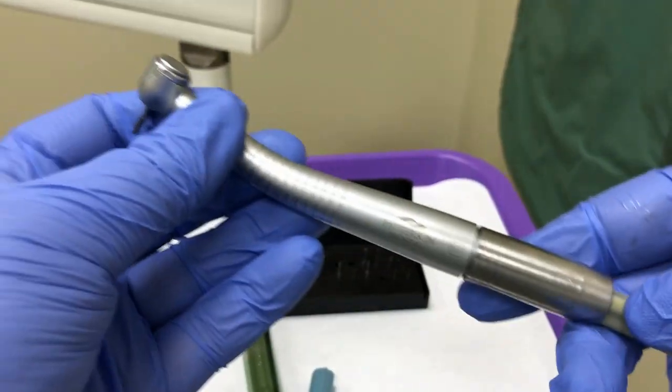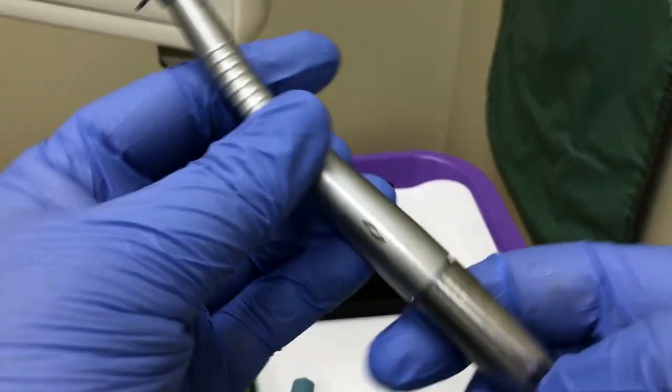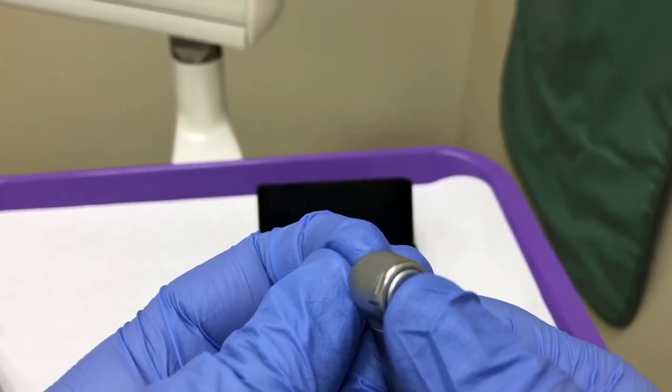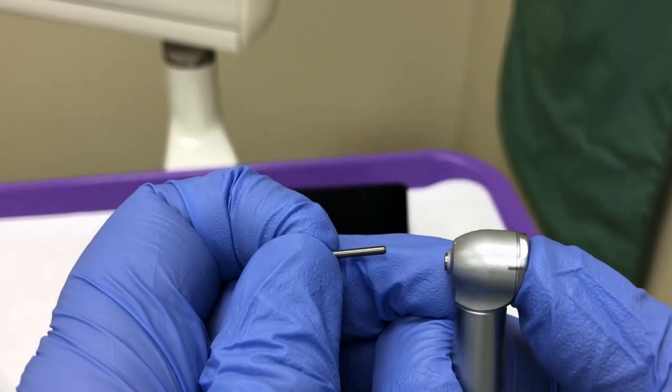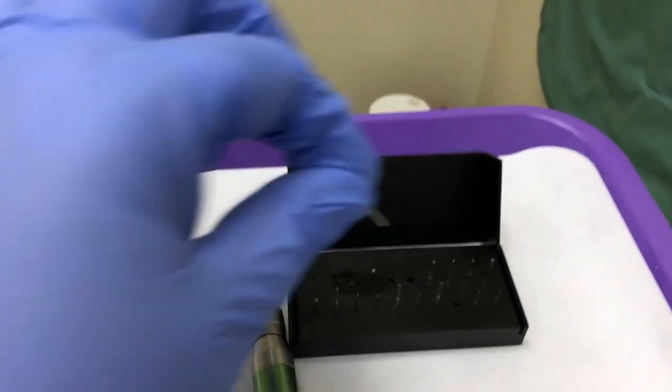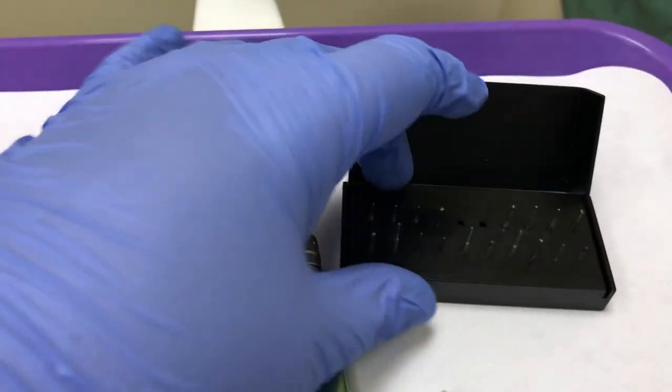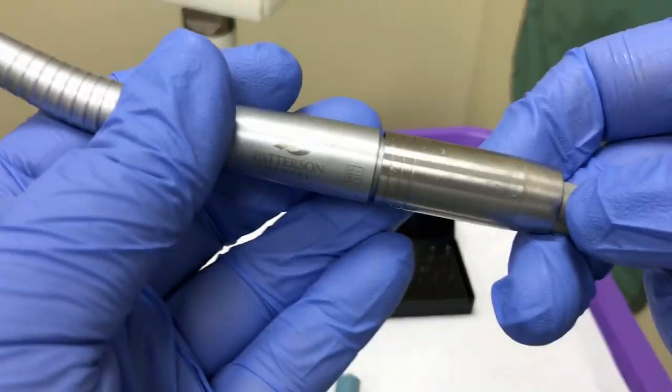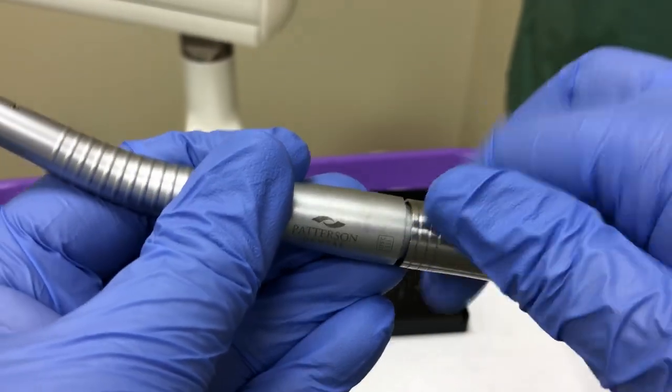To disassemble the high-speed handpiece, remove the burr by pushing on the back of the handpiece to unlock it and pull the burr firmly out. Place the burr into the burr block and then the entire burr block will be taken to sterilization. Unscrew the coupler to release the handpiece from the hose.